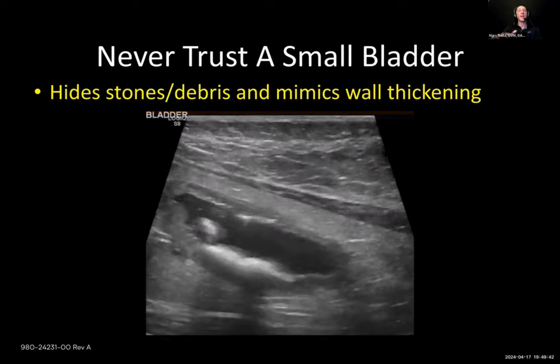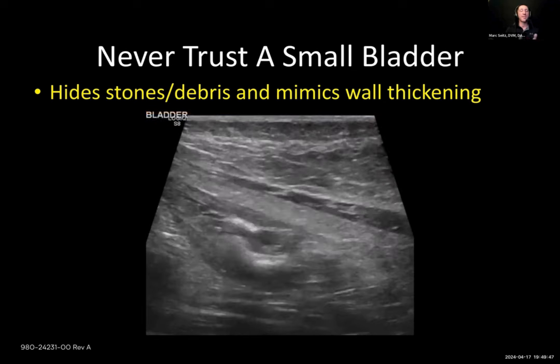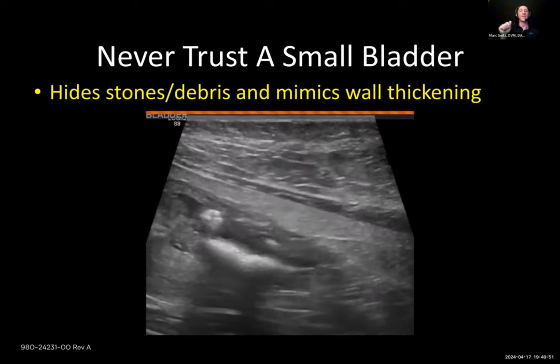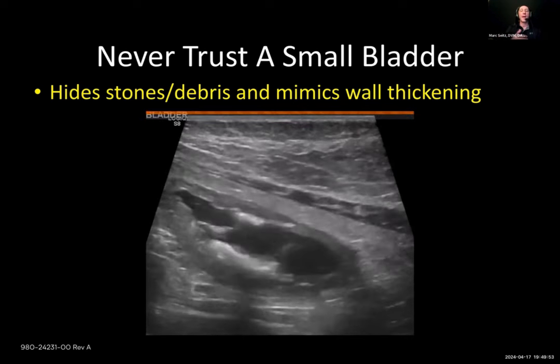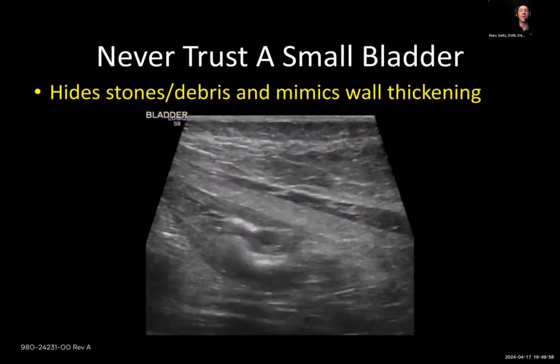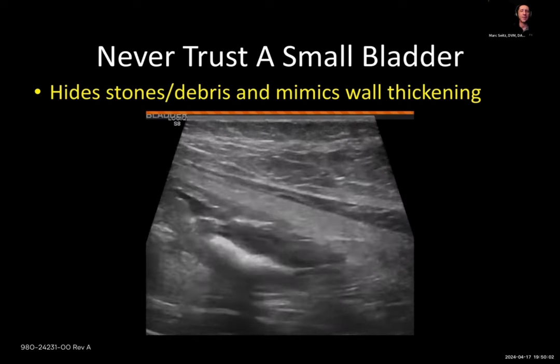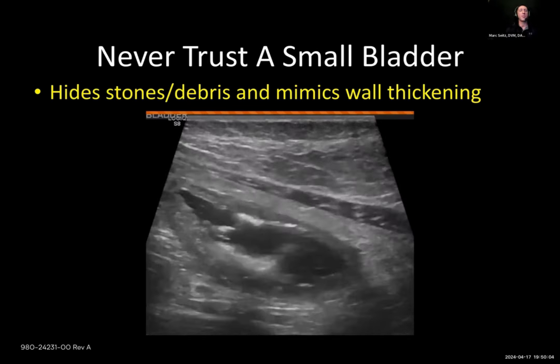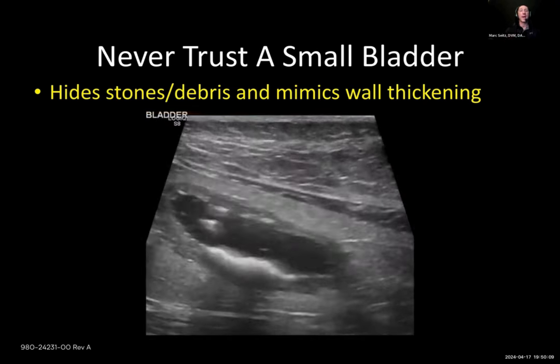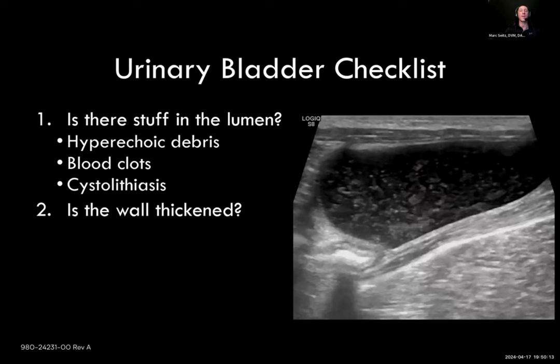In those animals, sometimes what I would do is I would say, hey, I can't get a urine sample. I can't evaluate it. I'm going to start empirical therapy for interstitial cystitis. Bring your cat back in 3, 5, 7 days, whatever your interval is, and recheck our point-of-care ultrasound at that time, get our urine sample, send it off, make certain we're not overlooking crystals, infection, something of that nature. And it was just a nice way to ensure that we were treating idiopathic cystitis and it didn't fail. It also helped bring that animal back to us for a recheck to make certain that they were improving.